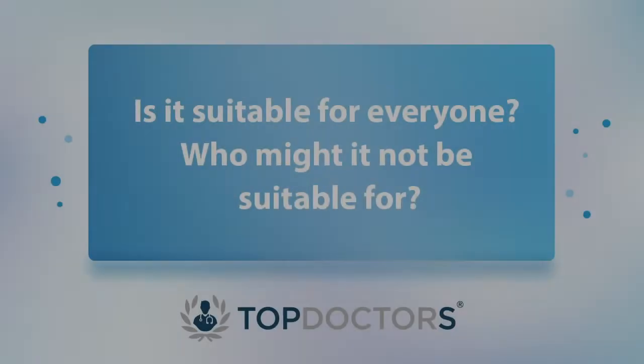Once the catheter comes out, majority feels a little bit urgent and frequent for a week or two, but that settles down on its own accord without any further intervention. There is a small risk if the prostate is sizable, that the first trial without catheter may not be successful and may have to have a catheter back in for another 1 to 2 weeks, and that comes out, but that's in practice quite a rarity. Thankfully, there is no major risks involved in this modality of treatment.